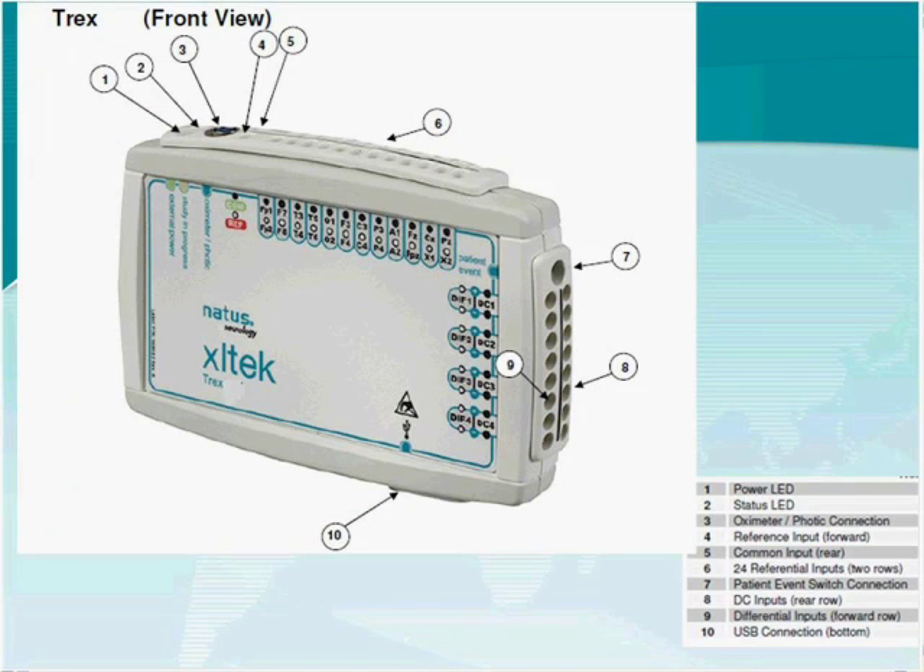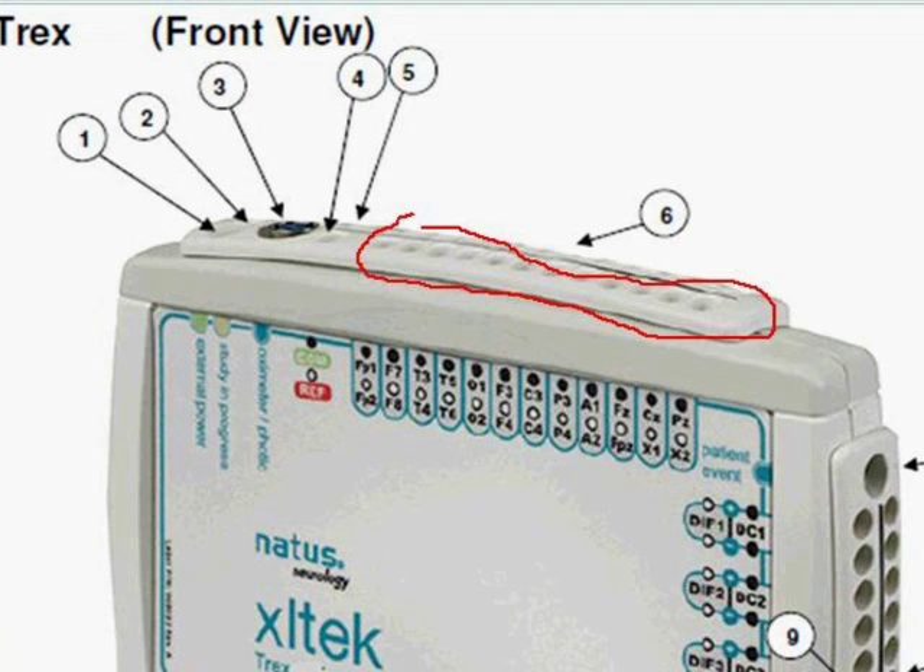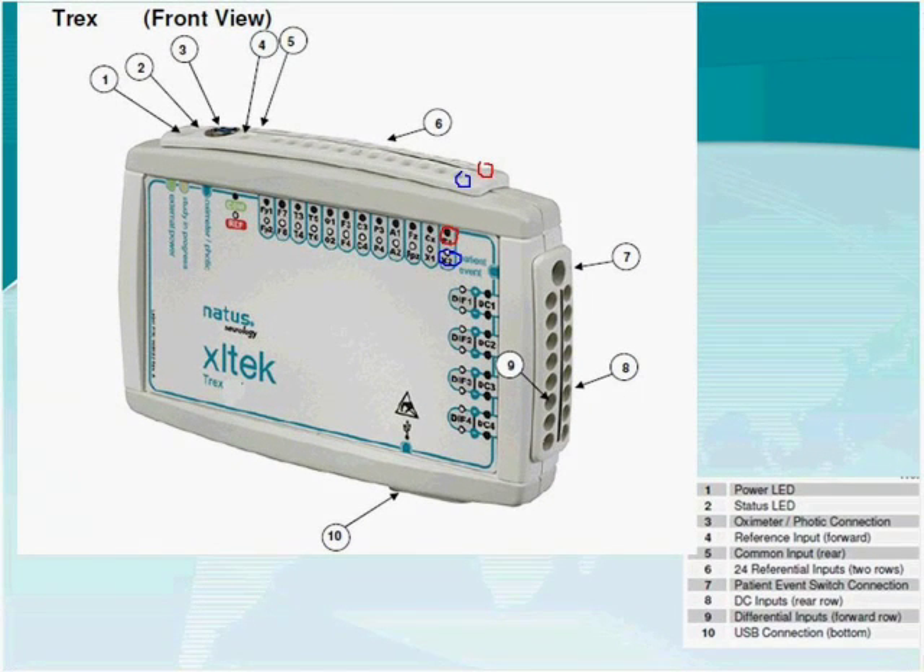The Trex contains 24 referential AC inputs across the top — one row in front and another row behind. There is also a separate reference input and a separate common ground lead, so the Trex utilizes both a separate reference and a separate ground. Looking at the side panel, you will see four differential AC inputs: diff one, diff two, diff three, and diff four — each with a positive and negative terminal.